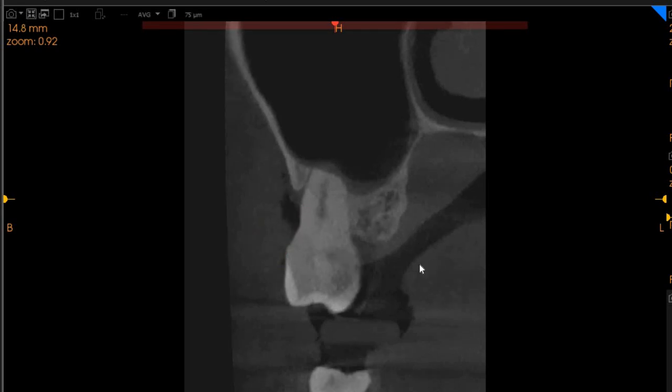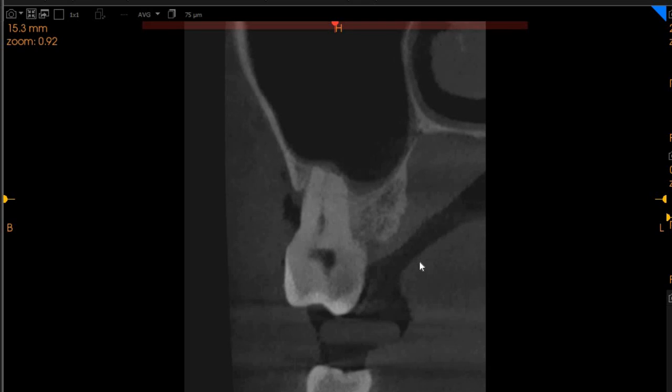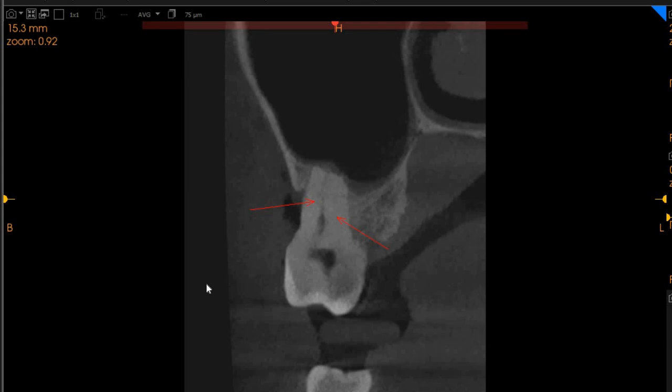As we move towards the canal morphology, we can only see one wide canal in the MB1, MB2 area. Either it's sclerosed or cannot be discerned. There are a few signs of it, but we definitely consider this a sclerosed canal.